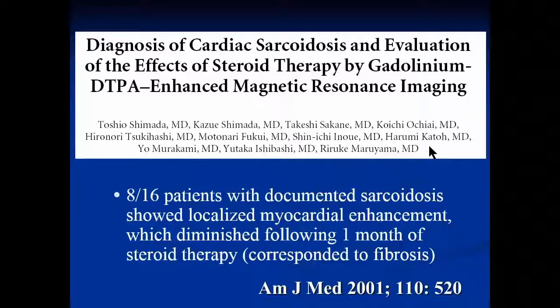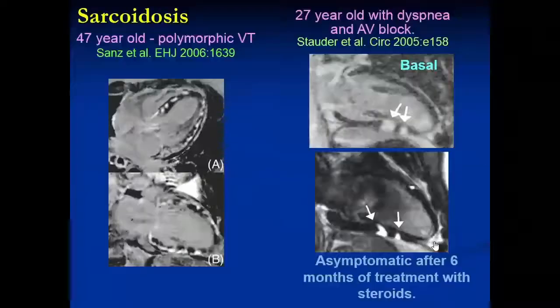The issue there is that fibrosis with inflammation is the right trigger for arrhythmias. These patients generally present with a dilated heart. Sometimes the heart dimension is actually not that abnormal, but if you see these blotchy areas of delayed enhancement in a patient with arrhythmias, even if it's just PVCs, but a significant load of PVCs, that's bad news.